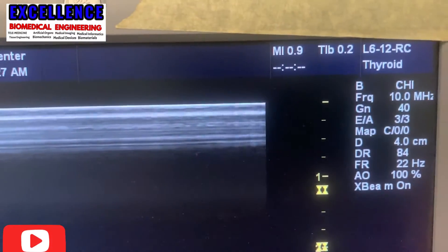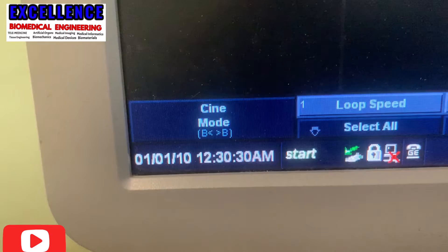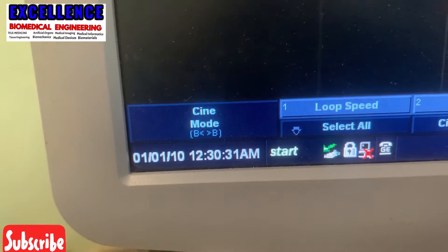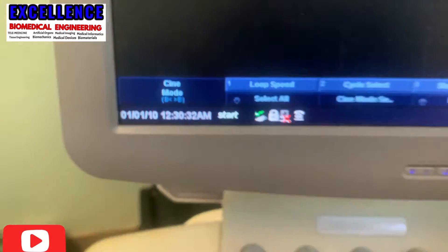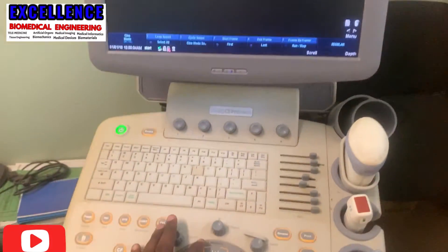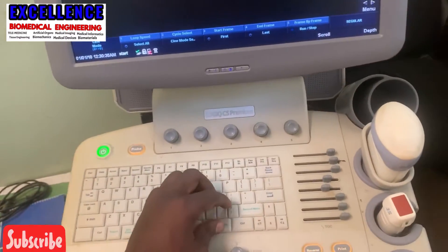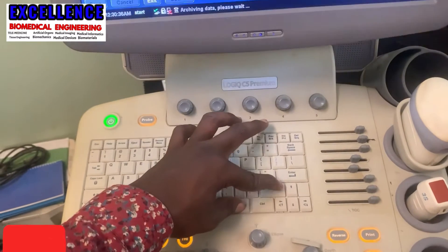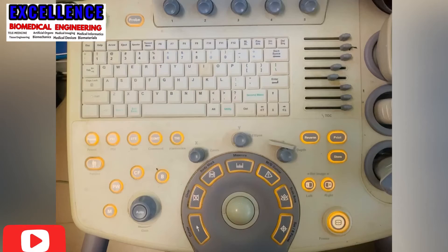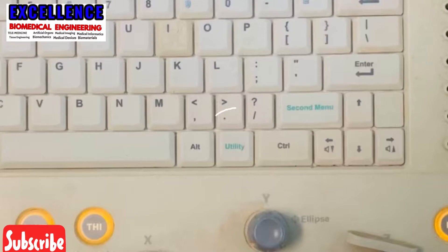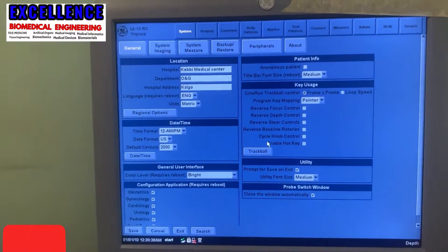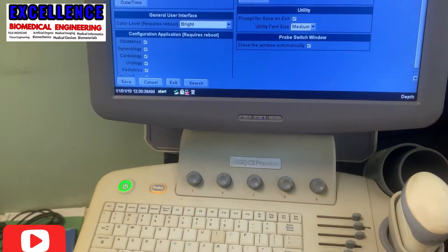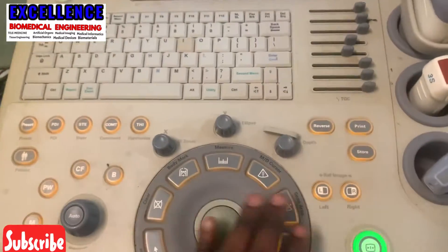Now let's go. This ultrasound machine is on the wrong time setting — it is showing 2010 and 12 AM, while it is not 12 AM at that moment. Look for your keyboard where you see the utility button or the menu button, click it, and it will take you to the menu.